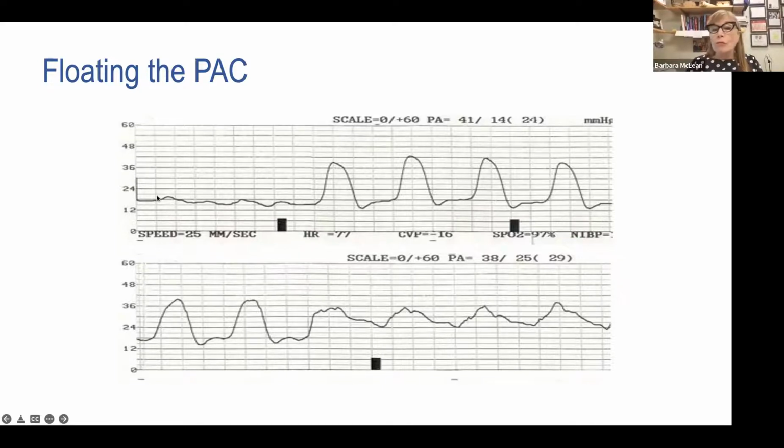Anyway, the catheter enters in the right atria, and we inflate the balloon. The catheter, with very gentle guidance and a very gentle push, moves through the tricuspid valve into the right ventricle. And that's where we are here. And we can really understand the uniqueness of the right ventricle, because you have a very rapid slope to the peak, and then a rapid fall, and then you plateau. Then the catheter moves through the pulmonic valve, and now we are up into the pulmonary artery.